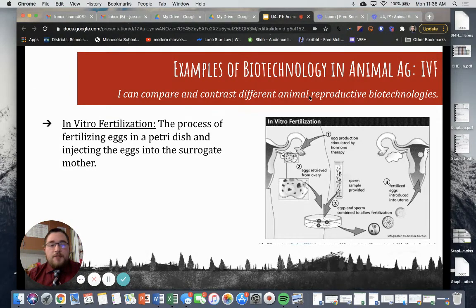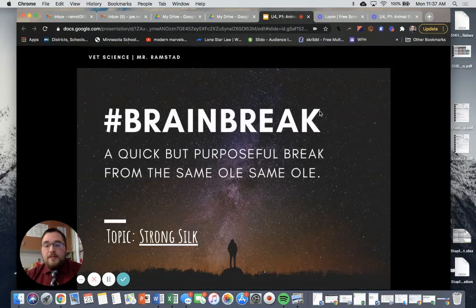First, the egg is produced by hormone therapy. The eggs are retrieved from the ovary. The eggs and sperm are then combined in the petri dish to allow for fertilization. And then those fertilized eggs are introduced into the uterus.